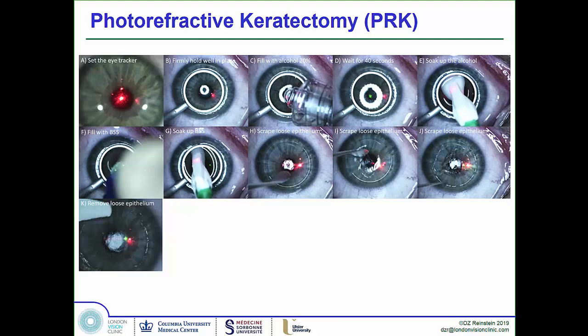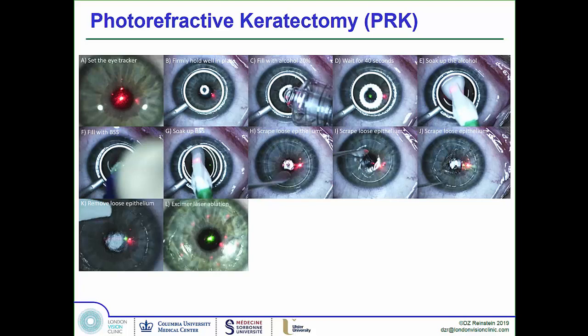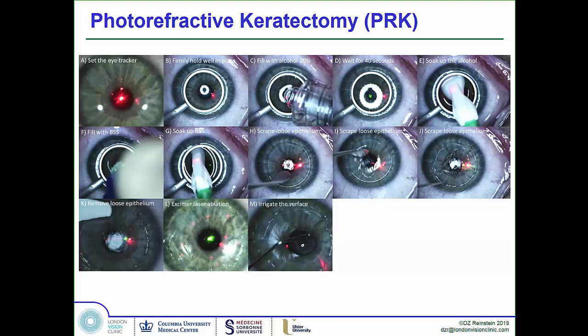You push the epithelium away from the demarcated region where the well was. Now you have a clean surface, and you perform the excimer laser ablation of that clean stromal surface — Bowman's. At the end, you irrigate the surface to wash out all the inflammatory components released from the cells that were broken up during the ablation, then dry the surface and check that everything looks clean.